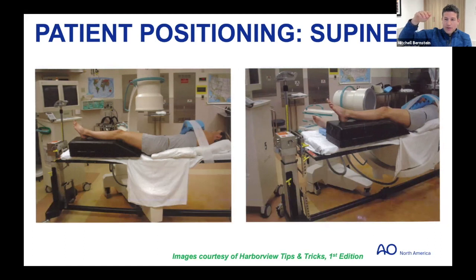We discussed this with Matt Camuso. We're doing nailing last week, and go just past the edge of the skin so that the entry point is exposed lateral to the bump and lateral to the edge of the bed. So I agree 100%. And people who pay attention to that realize, oh, it's not that bad, especially if your starting point is at the iliac crest, right? If the patient is very large.